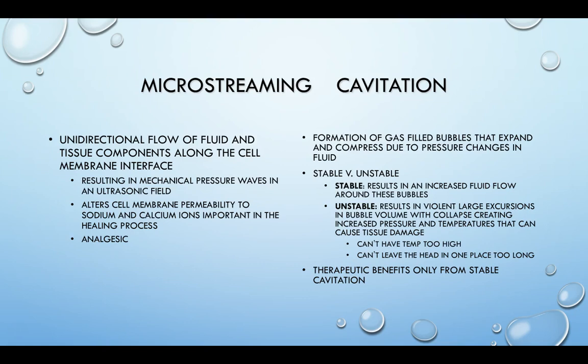This is where we get violent excursions in the bubble volume. So they blow up really big and then they completely collapse and pop. And obviously all that pressure change can be really damaging to the cells around it. So it can actually cause tissue damage. So if your temp is too high, or if you leave the head in one place too long, we're more likely to potentially get an unstable cavitation.